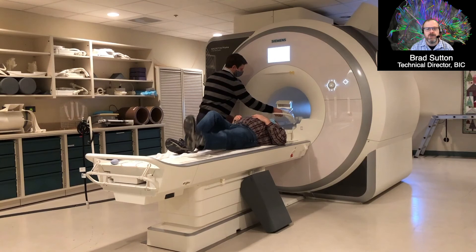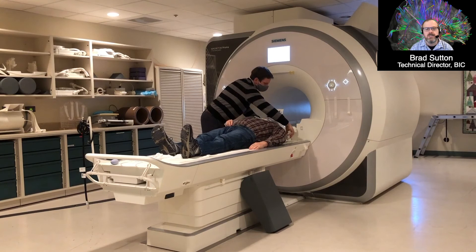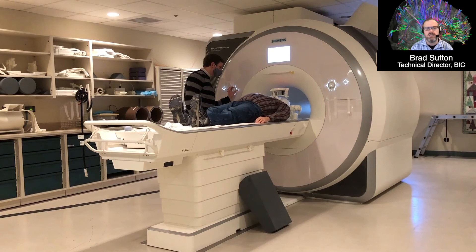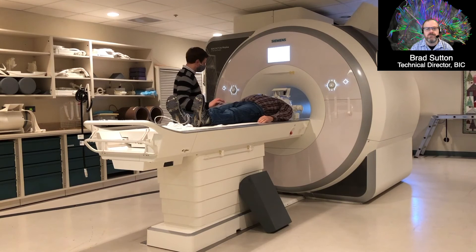Here we see the subject getting into the scanner to get ready for the experiment. They have headphones and earplugs because it's a really loud scan, and we need to be able to talk to them to give instructions. That coil being placed over the head is a set of antennas that listen to signals coming from the brain. It has lots of elements arranged around the head so we can image very quickly, with each element sensitive to the tissue closest to it.